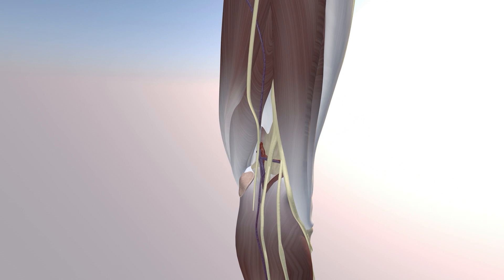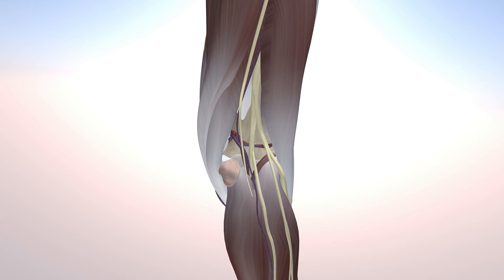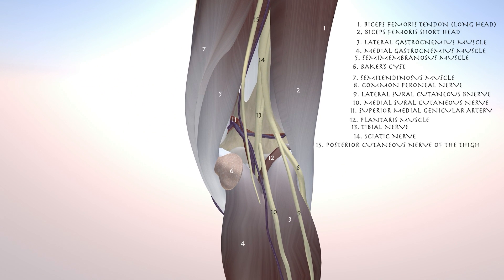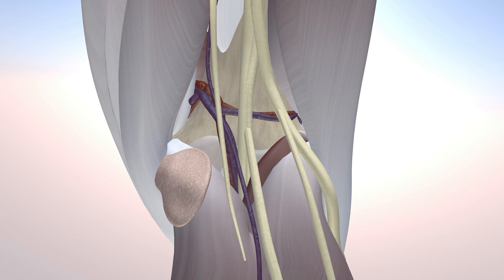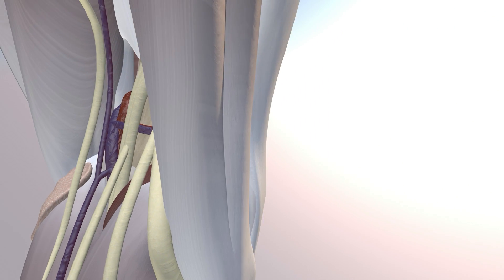You can appreciate some of the neurovascular structures on the back of the knee. This patient did not have a Baker cyst, but this model does delineate a Baker cyst. You can also appreciate the medial and lateral sural cutaneous nerves that branch off the common peroneal and tibial nerve.